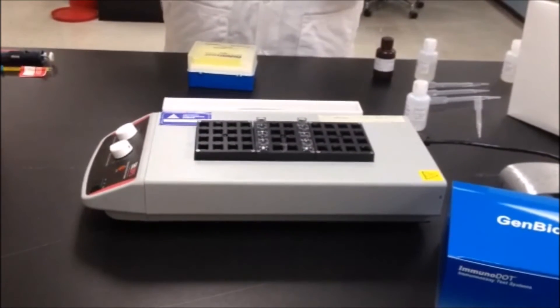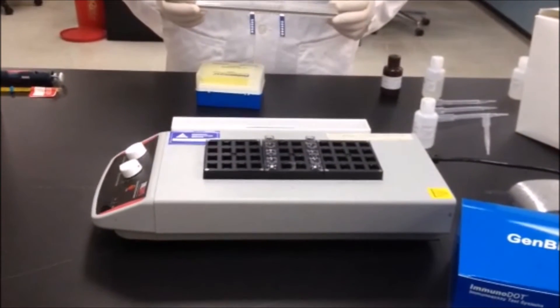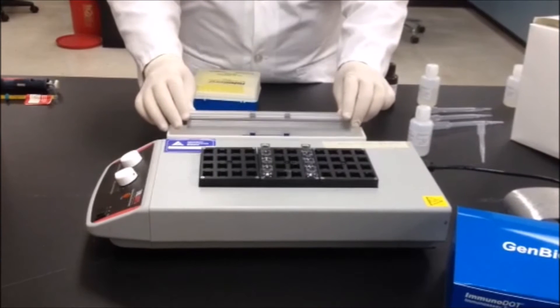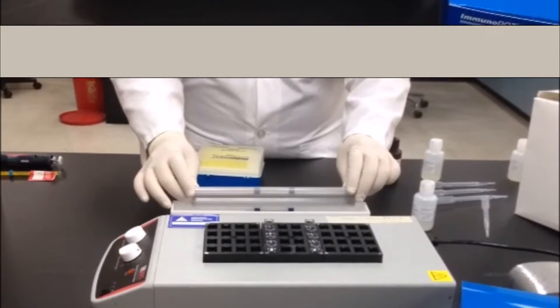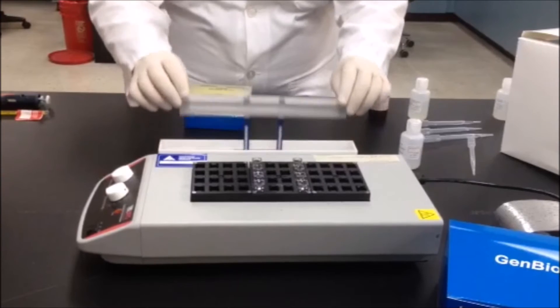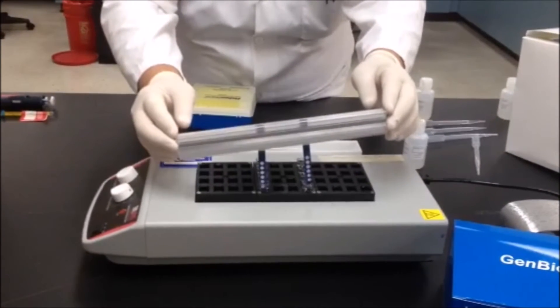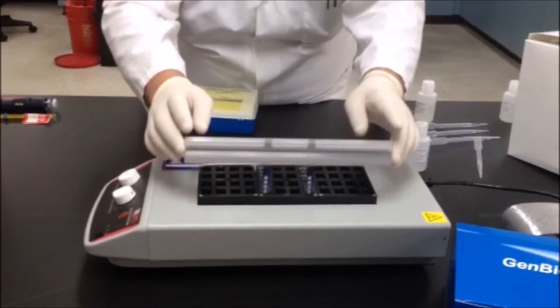It's important to pre-wet the reaction strips in the wash to optimize reaction with the patient serum. Simply dip the reaction strips into the wash. Then immerse the reaction strip into the first reaction vessel containing the patient sample and assure complete mixing of the patient sample and diluent using several quick up and down motions with the reaction strip.